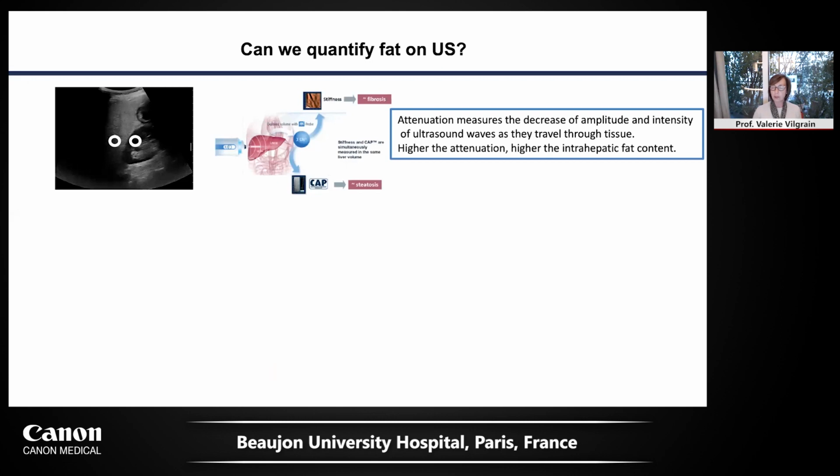The second question, as we have seen, is can we quantify fat on ultrasound? Well, we have known for many years that fat quantification is important. We have done that semi-quantitatively for years. We can use several ratios, like the hepatorenal ratio, but the reliability was not that great.